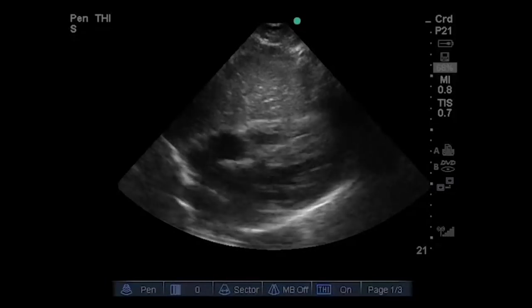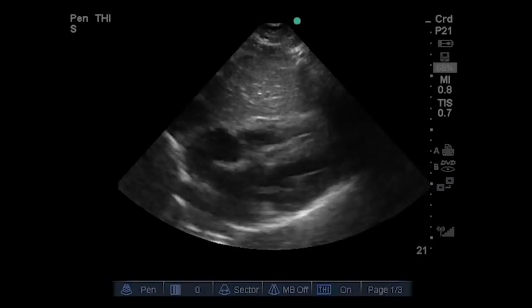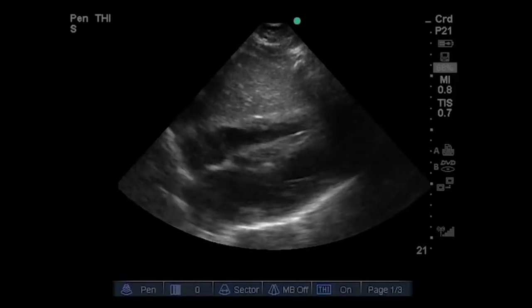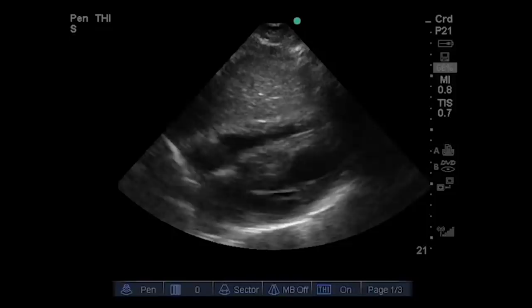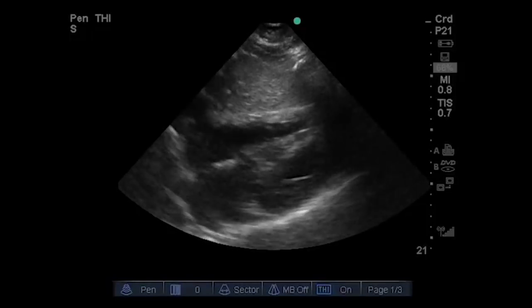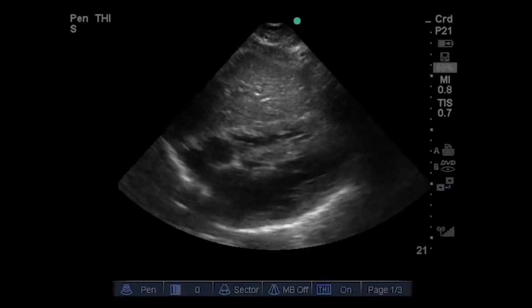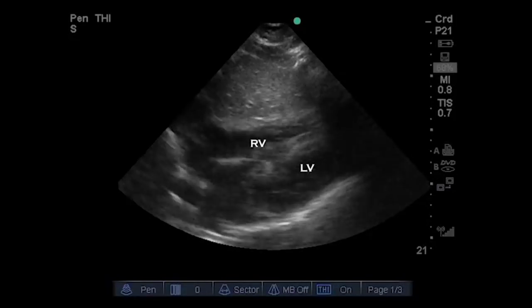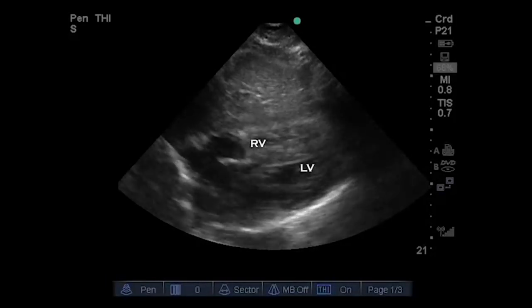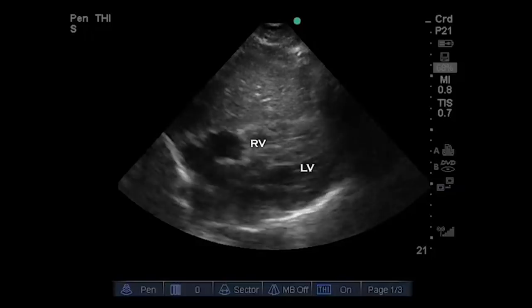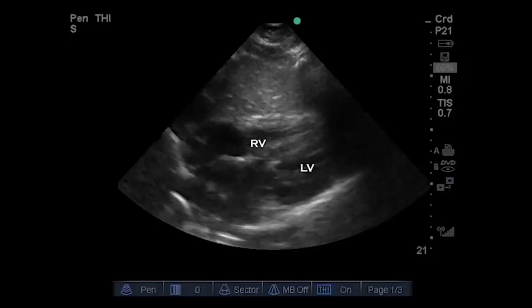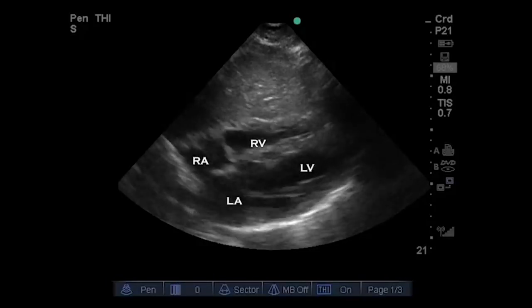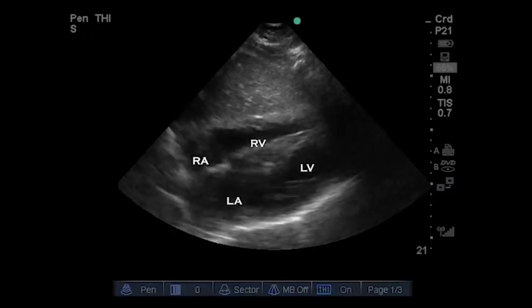Frequently, this is the best or even only view that can be obtained in the critically ill patient, particularly if they're hyperinflated or if they're on a large amount of PEEP. Let's go over the anatomy. We have the LV cavity, the RV cavity, and the pericardial space, which is virtual in this situation. There could be some attempt made to visualize the atria, though sometimes that's difficult to line everything up, just as it is with the apical four-chamber view.